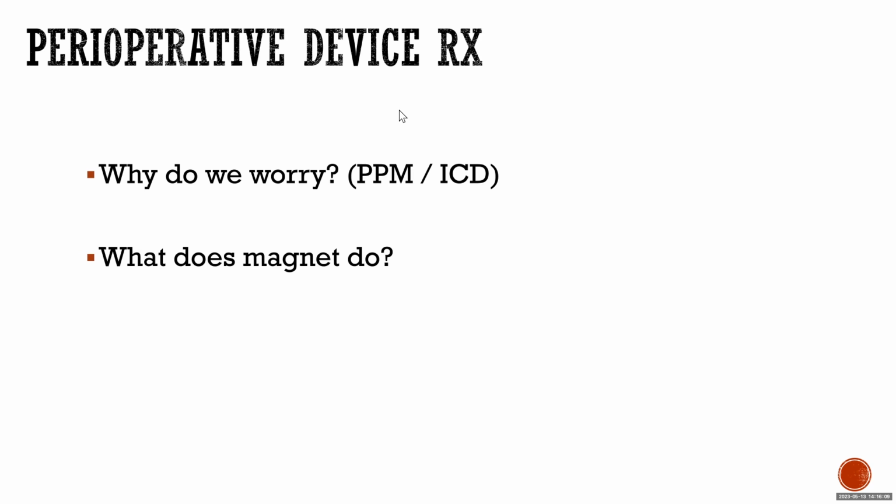What about ICDs? Will not shock. Exactly. It will inhibit shocking. Good. Switch off. Yeah. Exactly. This is going to be relevant to the algorithm I'm going to show you.